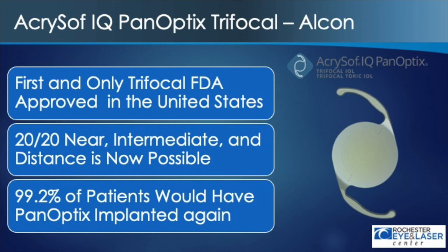The other thing we always look for is people who take their glasses off to read, and there are a lot of them. Especially if you're a woman and you take your glasses off to read, you can also put your makeup on without your glasses because that's a near task. So those patients, I always encourage them, if they've got otherwise healthy eyes, to consider a multifocal lens because it's going to make them really happy, okay? I've used this lens a lot in the last few months, and I'm really loving it.